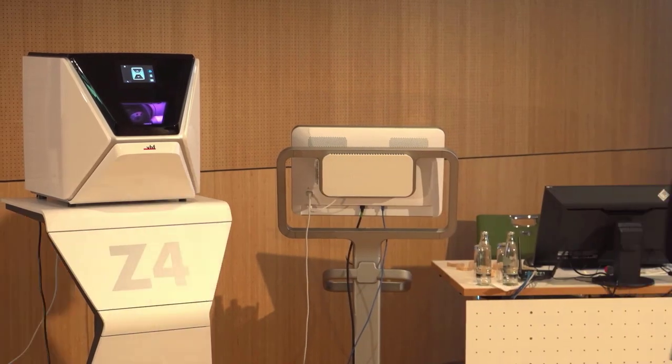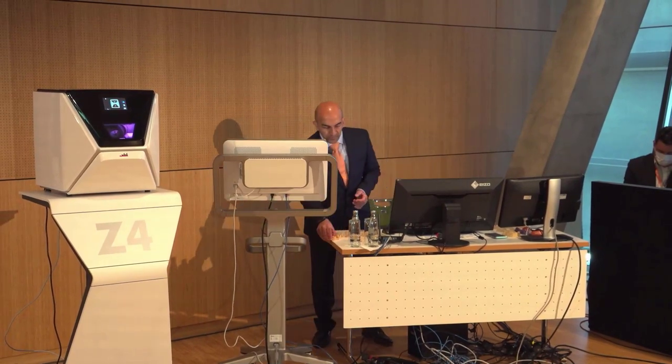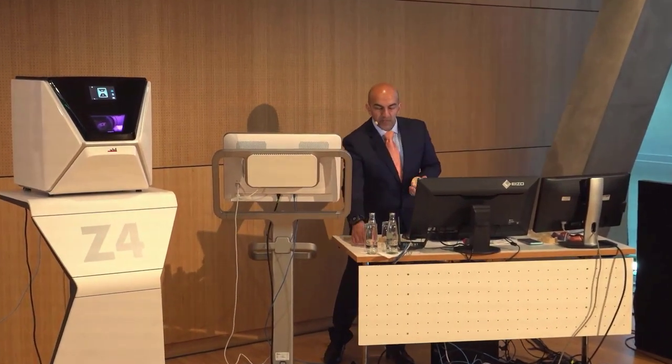We're going to go through different complexities, starting with a very simple case. We'll be milling live, and my colleague Udo is going to help us with printing, so we'll be printing live as well. I have a couple of models here to work with.